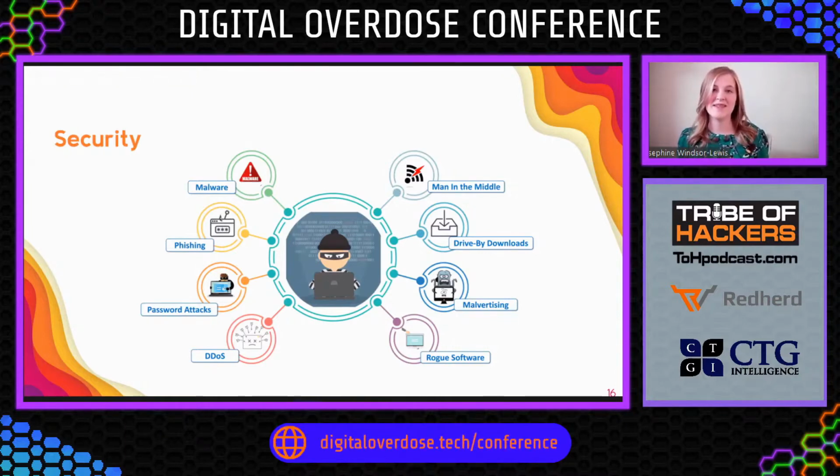As well as that, we wanted to transmit the data back to a medical setting so it could be followed up on if any children needed further treatment. In our first couple of trials, we just sent unencrypted data straight over the internet to the hospital. Not ideal. It's really not ideal. So this is really vulnerable.